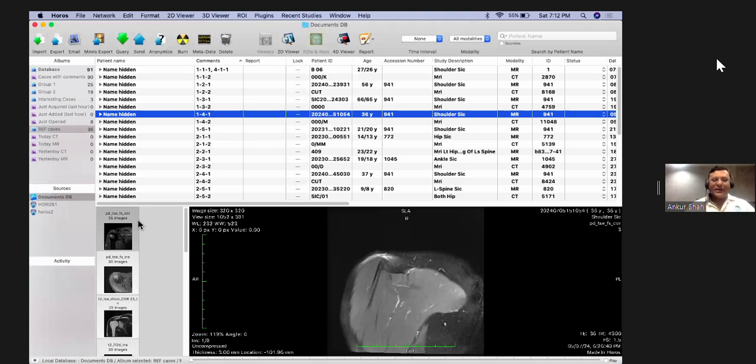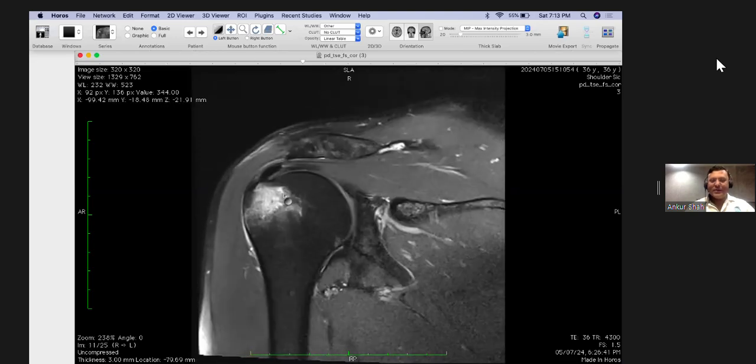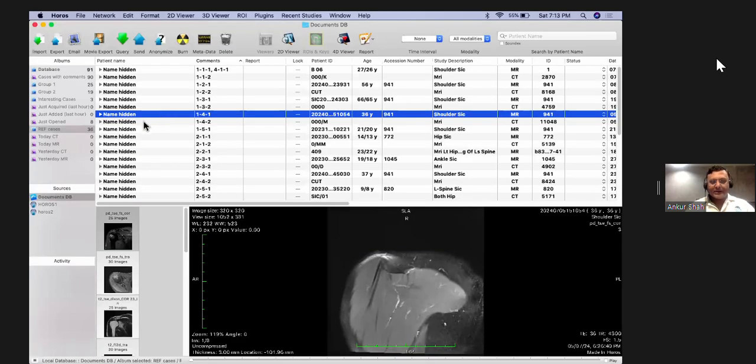Sometimes in calcific tendinitis the calcification can go within the bone also, and it can result in so much marrow edema. So that is the calcific tendinitis which shows intraosseous migration and results in significant bone marrow edema at the site of its insertion.